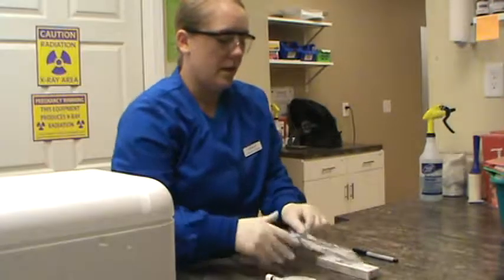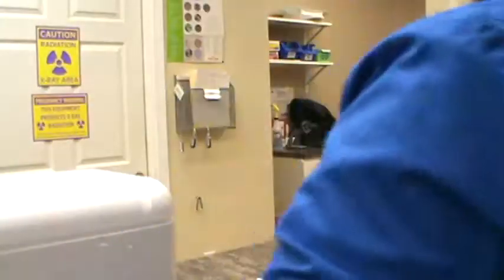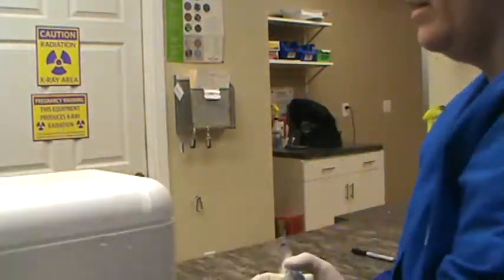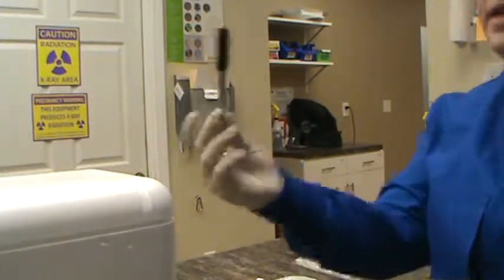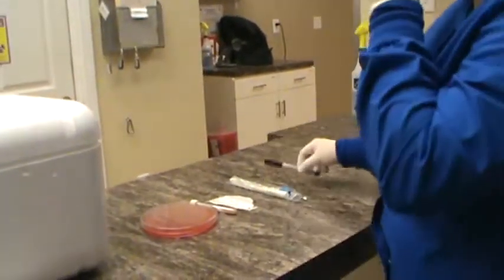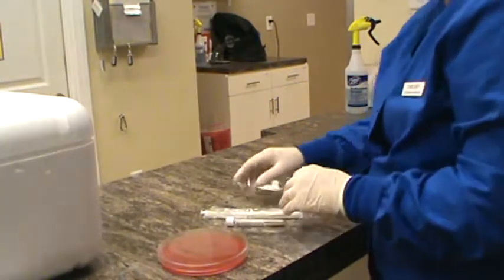And then let me come in close here. We have our antibiotic discs for later on. And we have a sterile swab that we're going to use to collect our sample. We also have a pen that we used to label our agar plate. So I'm going to go ahead and begin the culture and sensitivity.